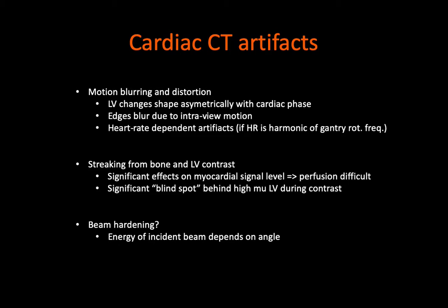There's also beam hardening, which is a kind of path-dependent process. If you, for example, come through the front of your body and then detect out the back, the x-rays that are making it to your heart will have to go through, for example, your sternum, which is a different path and will have a different attenuation than if they came in from the side, where the ribs and the spine aren't there. And so you can actually get artifactual differences in attenuation because of this beam hardening effect.